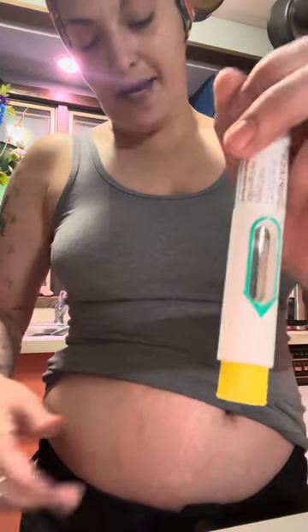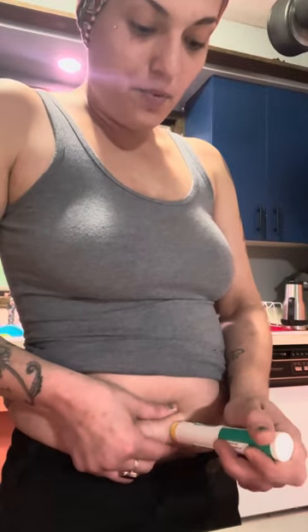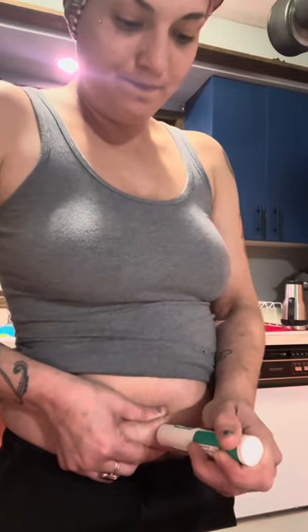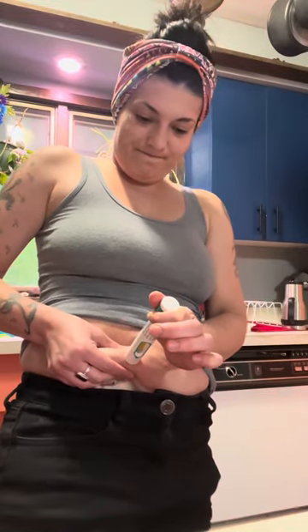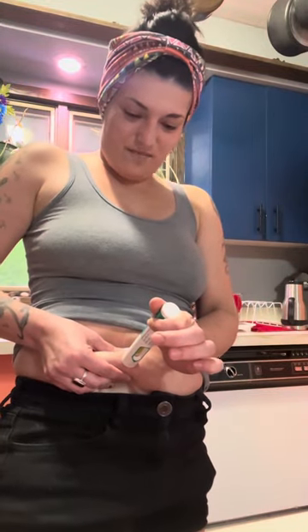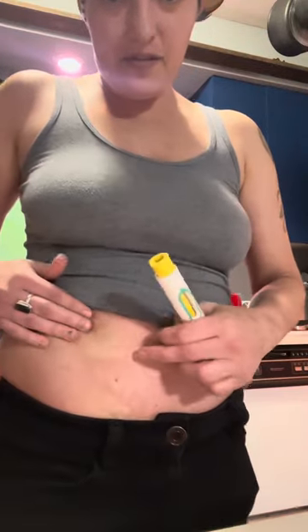I'm not gonna freak out this time. I'm just gonna get it done. You hold it against your skin and push — one, two, three. One, two, three. Then pull it out. Usually I don't bleed, but this time there's a little blood — it's not a big deal.